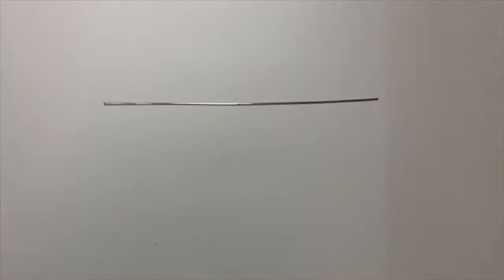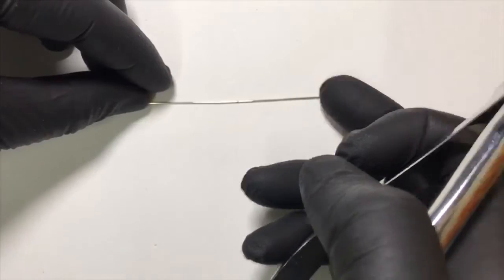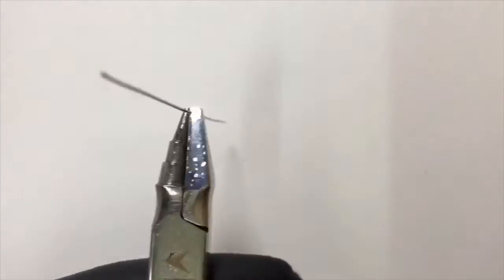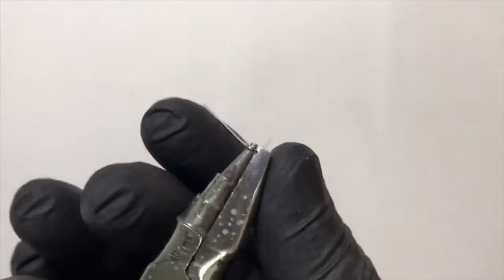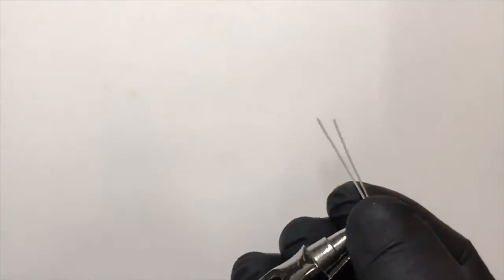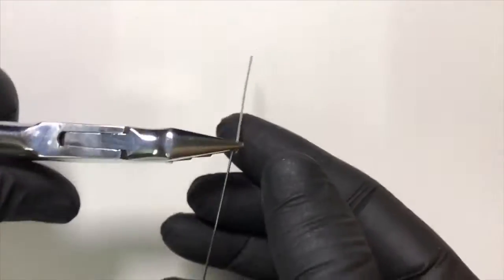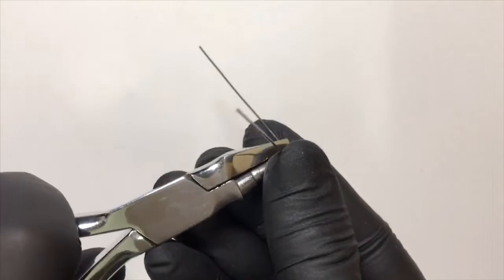We will use the rounded peak of the universal plier, engage the central point, and begin to form a helix. We bend both ends of the wire simultaneously — one wire over the other — applying equal pressure on both arms to form a complete rounded helix. This forms a uniform helix covering the rounded peak of the universal plier.